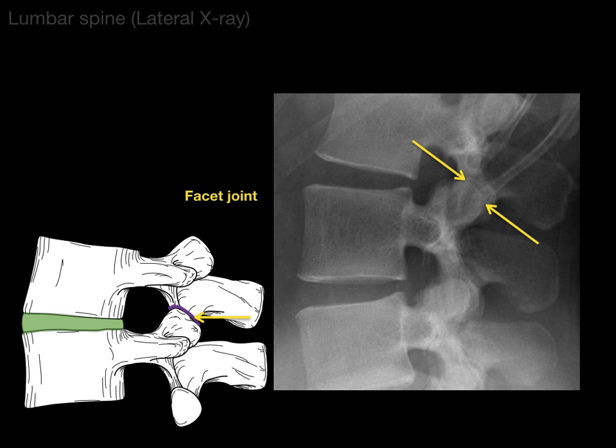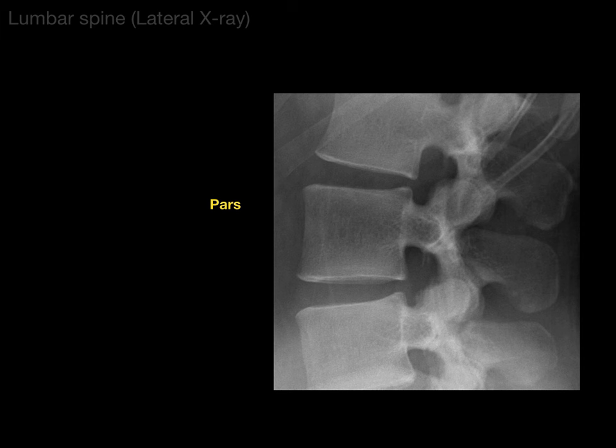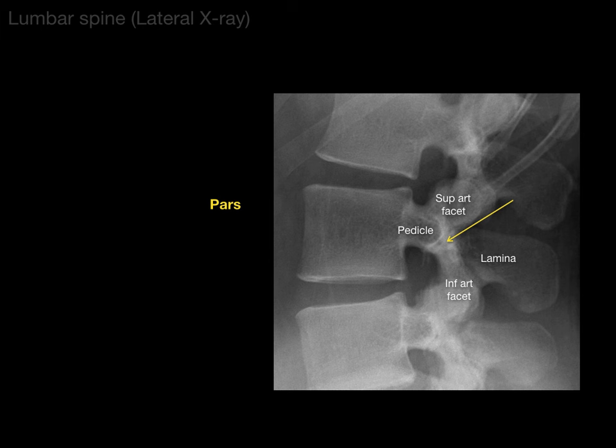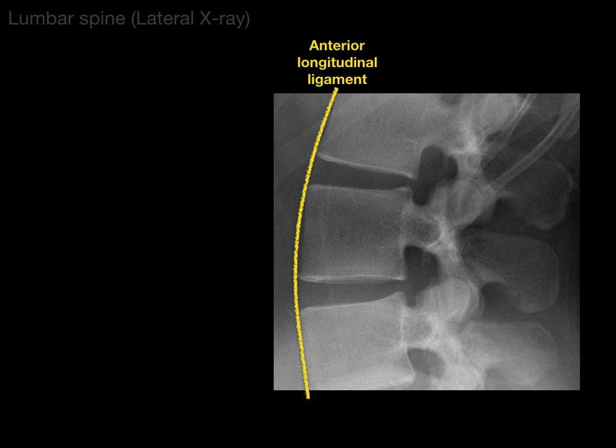Now, the structure called the pars, or pars interarticularis. It's hard to just point to at first. One of the ways you find the pars — which means 'a part of' — is to find these four structures and it's in between them. Find the superior articular facet and the inferior articular facet of the same vertebra, then find the pedicle and the lamina — and between all four of those, there is the pars. Also, the yellow line shows where the anterior longitudinal ligament would be located, and on the back of the vertebral body is the posterior longitudinal ligament.